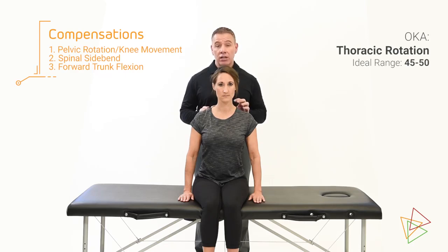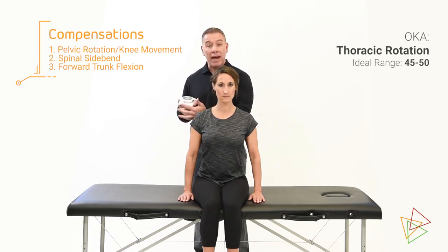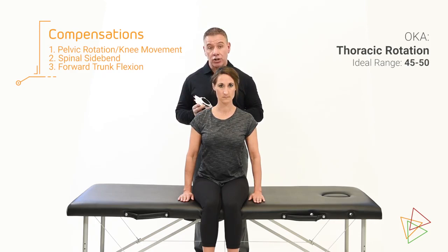Looking at thoracic rotation, we're going to use our two anatomical landmarks of the C7T1 interspace and the T12L1 interspace on their spine. We're also going to use the short side of the halo base. Remember, there are two different widths of these prongs, and you want to use the side that's most appropriate for the person that you're measuring.